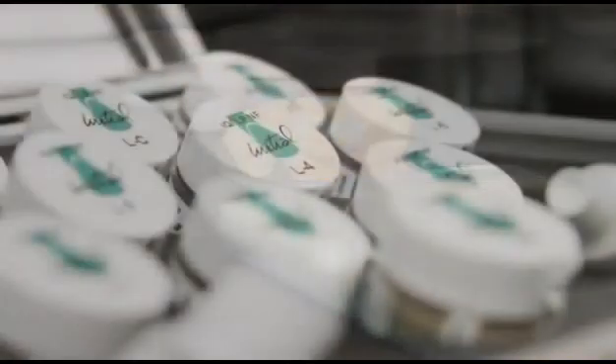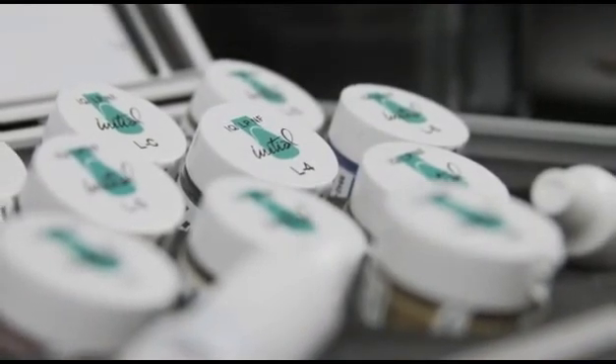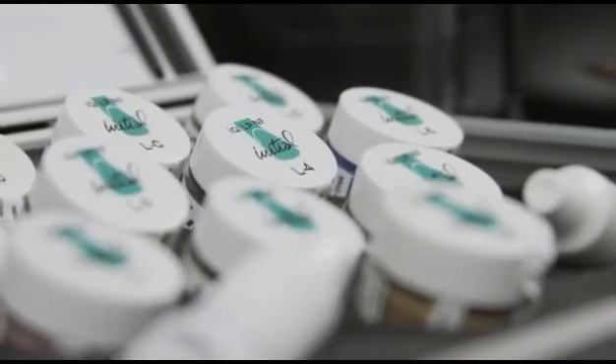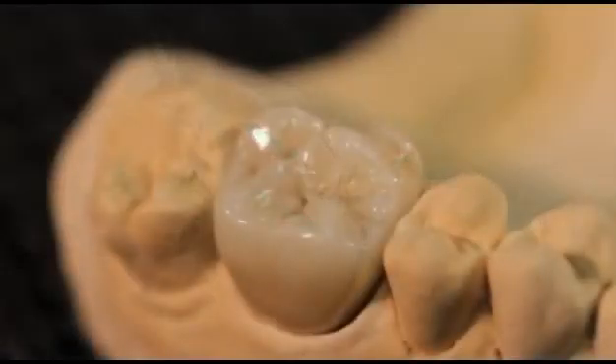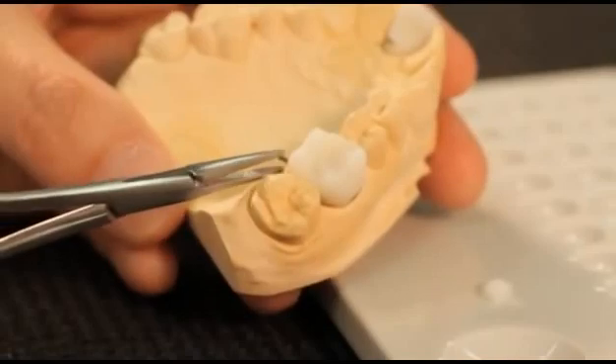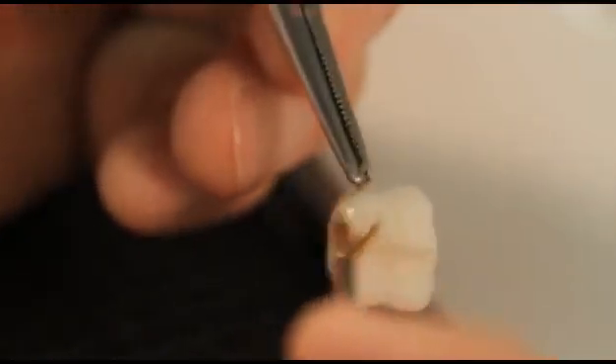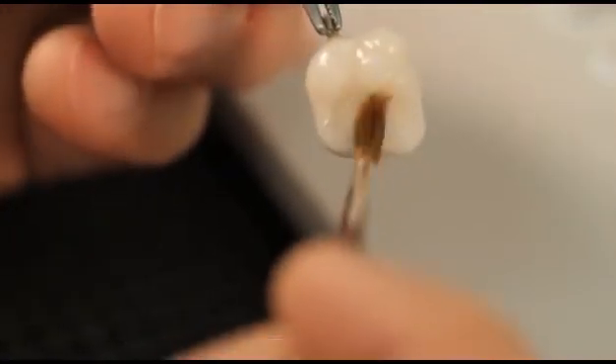Available in a ready-to-use consistency, the Lustre Paste NF are based on fine ceramic particles and can be applied in a thicker layer where they will exhibit unsurpassed vitality and a very natural glaze to your restorations. The Lustre Paste NF are a one-for-all solution for the complete Initial line from GC, usable across a wide CTE range between 6.9 and 13.3, in order to work with nearly all types of ceramic.